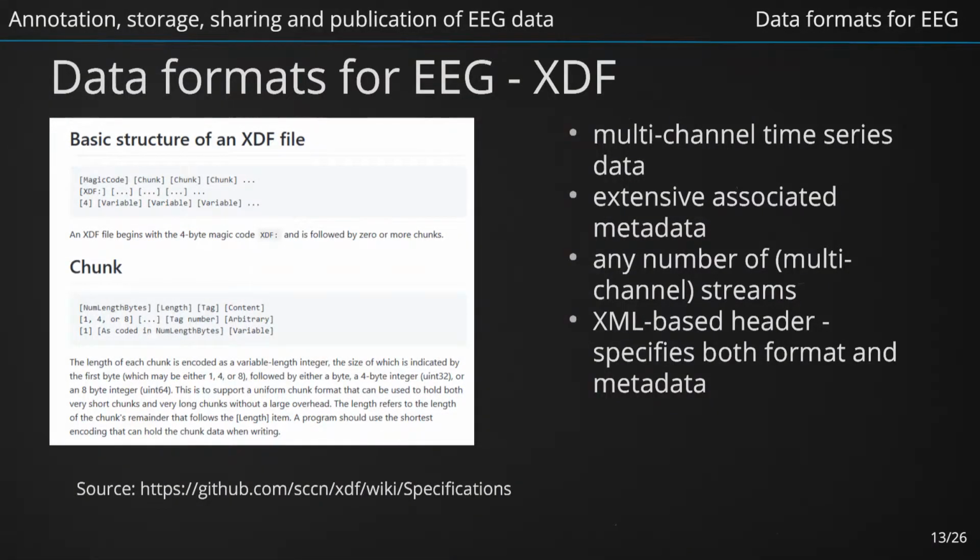Extensible Data Format, XDF, is an open-source community project and general-purpose container format for multi-channel time series data with extensive associated metadata. Except biosignal data such as EEG, EMG, EOG, it can handle data with high sampling rate or data with a high number of channels. Metadata are stored as XML.